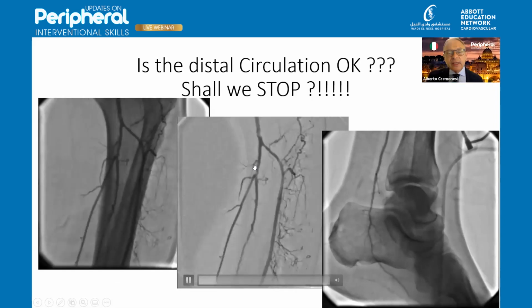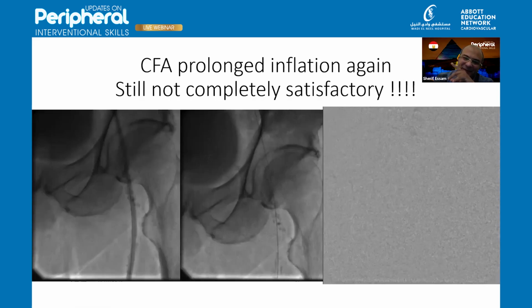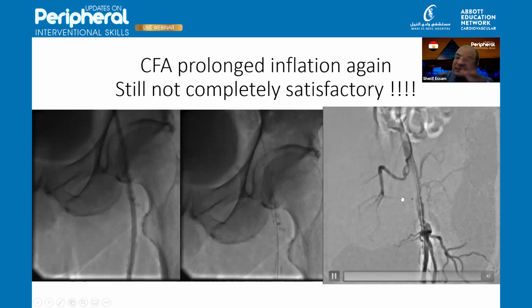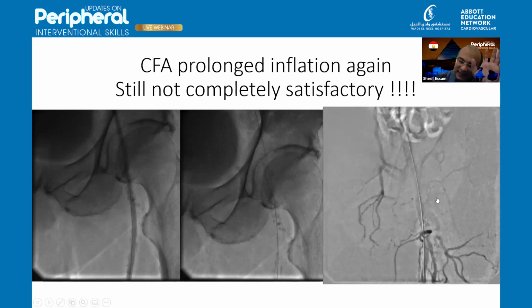I don't think that you can stop, leaving the inflow as it is. Yeah, I'll go back again to show how the inflow was. That was the common femoral artery. Okay, it's pretty much better than what we started with, but still, as is written here, not completely satisfactory.